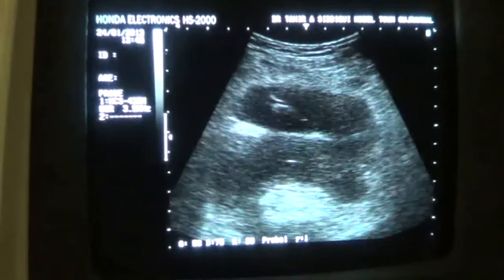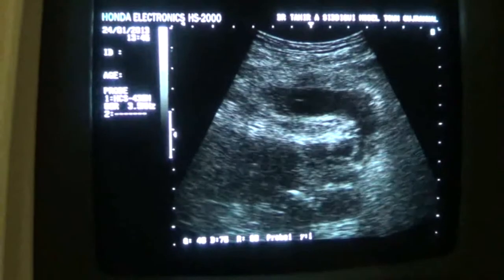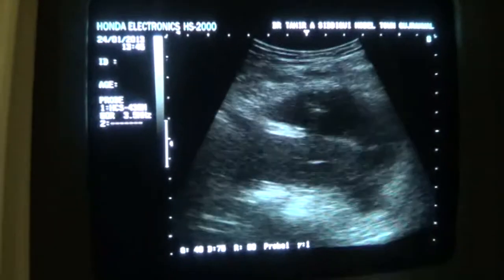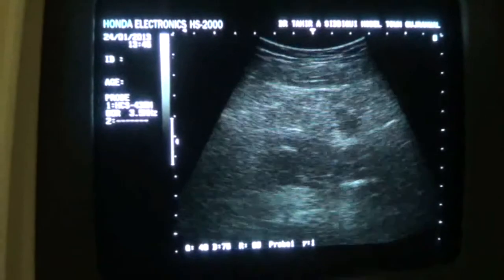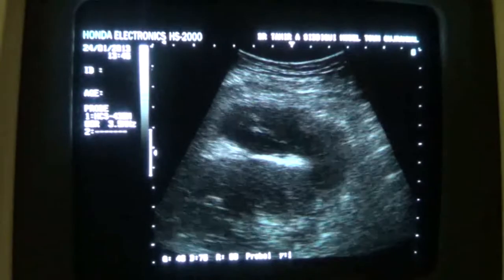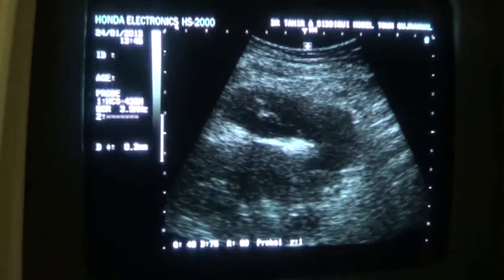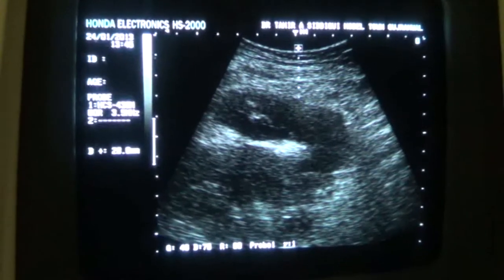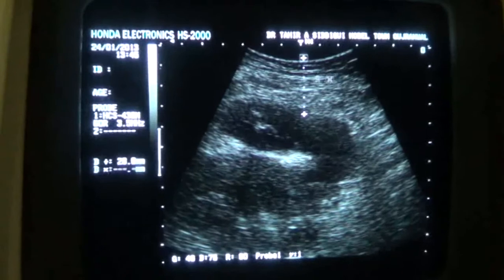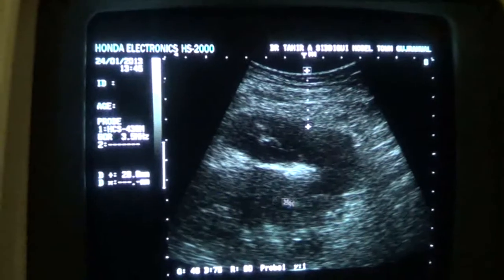And you see that this is the ovary, this one, left ovary. Okay. To me, it seems to be extending into the subcutaneous area, and the collection is only 28 mm deep to the skin. This is the skin in this region. This is the subcutaneous tissue. This is the collection, and this is the uterus.